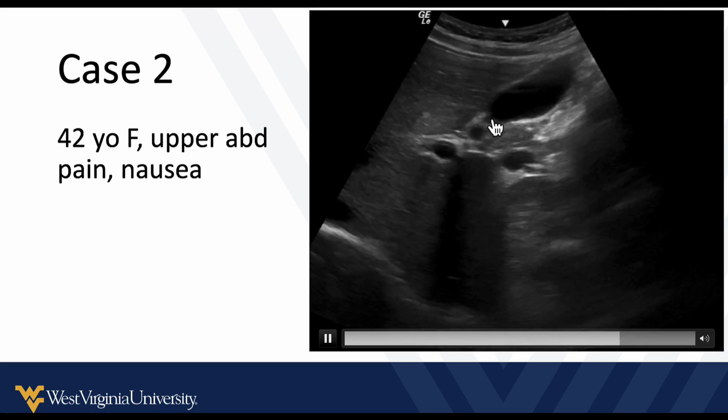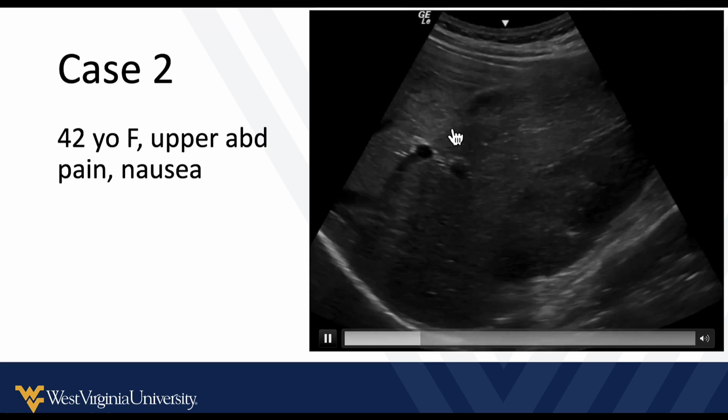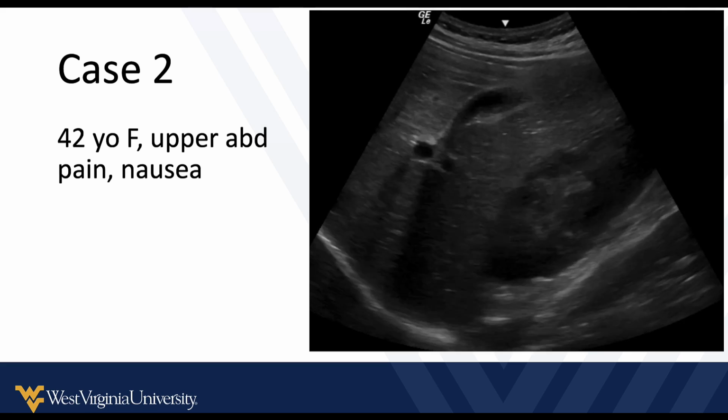This gallbladder looks perfectly clean. There's no stones in here whatsoever. The wall is nice and thin and bright and well defined. The portal vein looks normal. There's no dilated duct running with that portal vein. So this is essentially a normal biliary ultrasound exam.